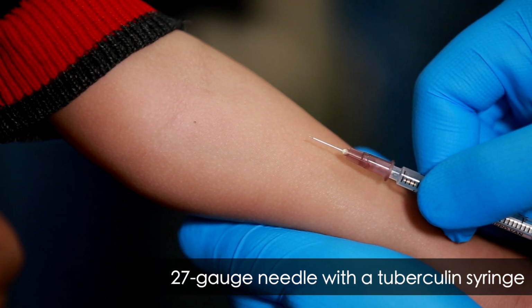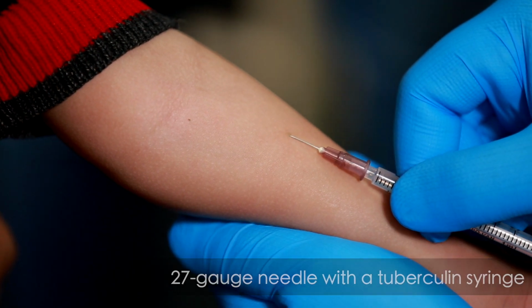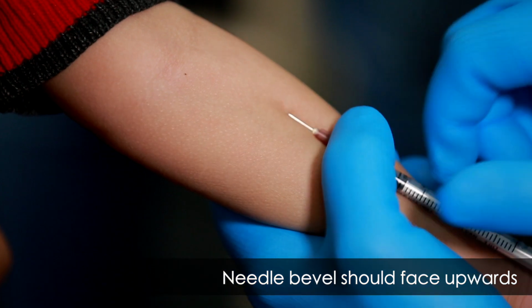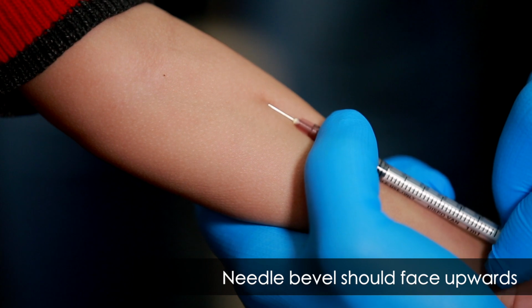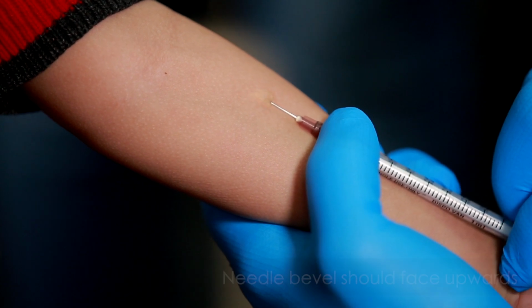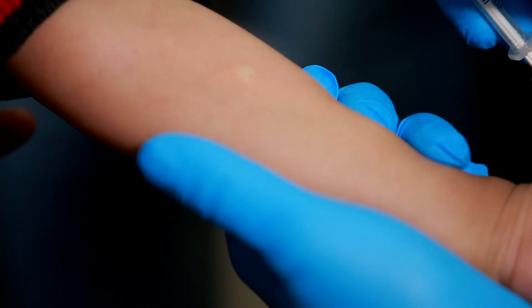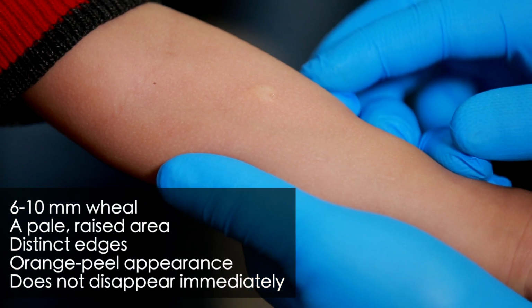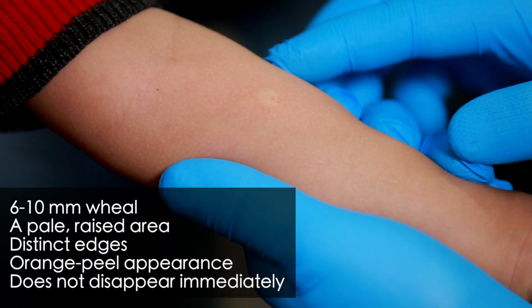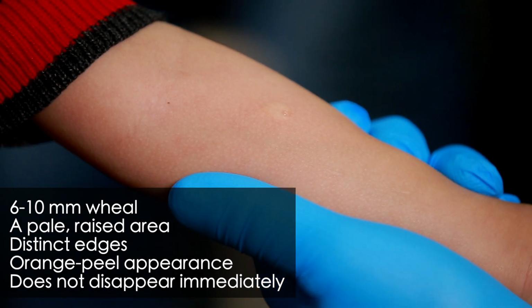The PPD should be injected using a 27 gauge needle with a tuberculin syringe with the needle bevel facing upwards. Avoid areas of skin with veins, rashes, or excess hair. Inject the antigen into the superficial layers of the skin on the volar surface of the forearm. A 6 to 10 mm wheal is formed, which is a pale, raised area with distinct edges, having an orange peel appearance, and does not disappear immediately.